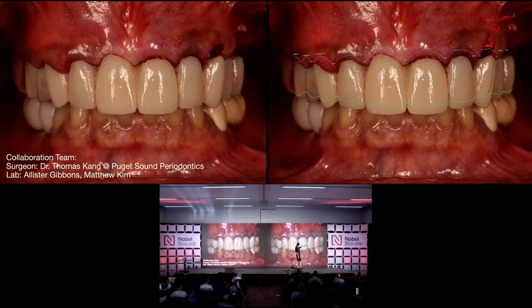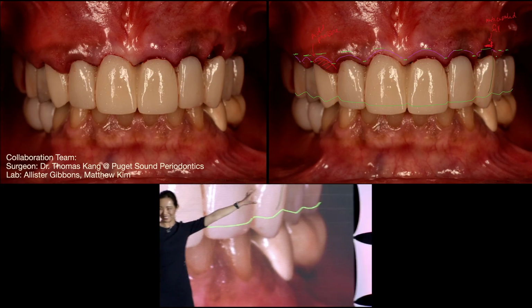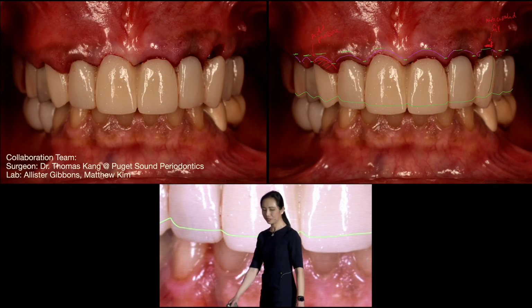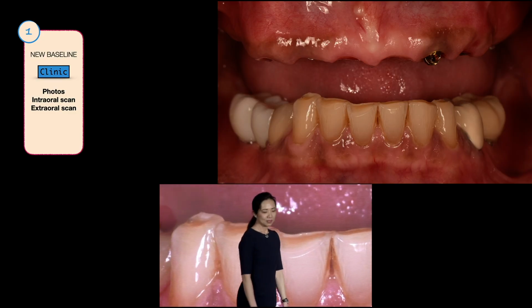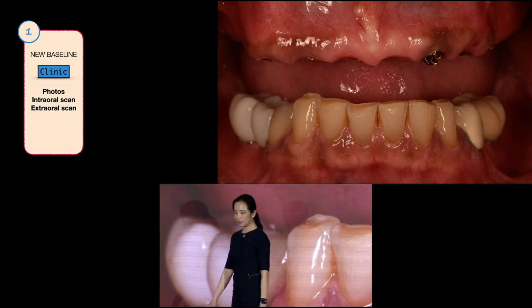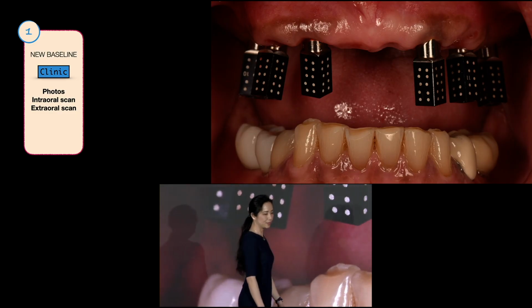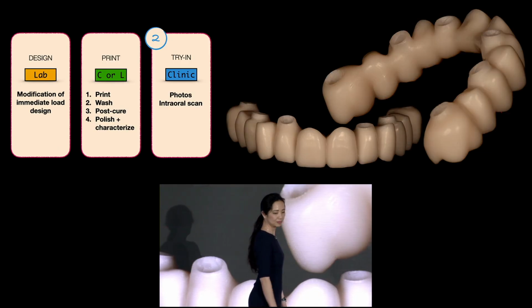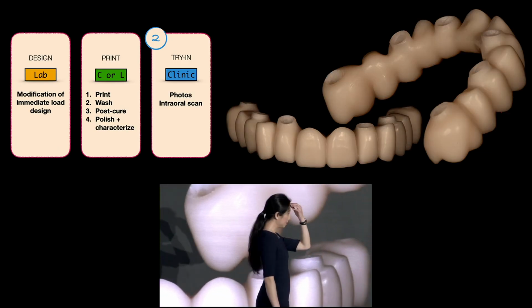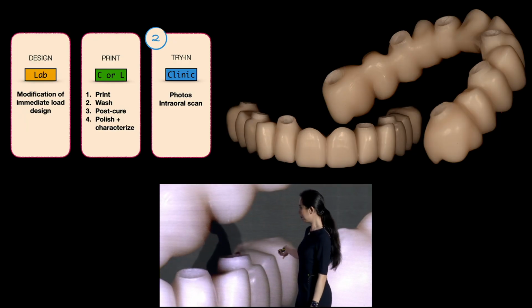And here, we just extracted a tooth, so I'm going to have to fill that back in, because they actually kept a tooth for the provisional. This is how the patient healed. Took a new ICam scan on the same visit. And from there, we print a new try-in.